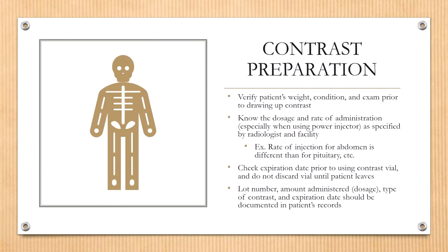Once you get all that information and you verify that the patient is able to get the contrast, you've run the GFR, everything's good to go, then you should go ahead and draw up your contrast as your patient is changing. I don't recommend doing that while they're in the room because it freaks them out a little bit. Make sure that you know your dosage rate.